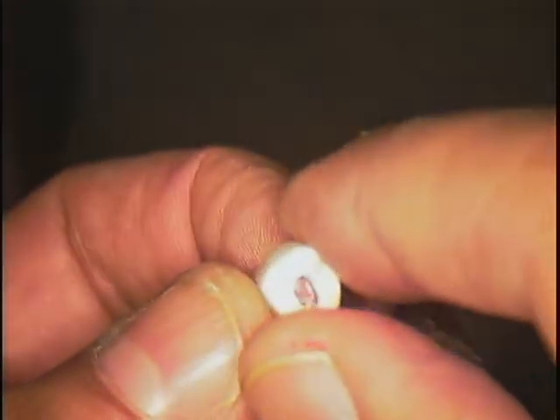patent. Patency is a term that we use to make sure that there's no blockage and that you're communicating with that infection and allowing it to drain, you know, through the canal. Because most root canals that are done have infection related to them, and not many root canals are done in one appointment. And it usually takes 2 appointments, one to cleanse and shape, and the second one is to fill.